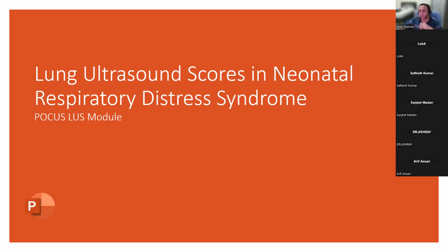In addition, some centers use lung ultrasound scores in trying to follow transient tachypnea of newborn. There's an overlap sometimes with cases of RDS, and again, the question then becomes how you use lung ultrasound scores in that particular context. And then there's a variety of different conditions that are currently being researched, in particular, the assessment of heart failure alongside BPD assessment.